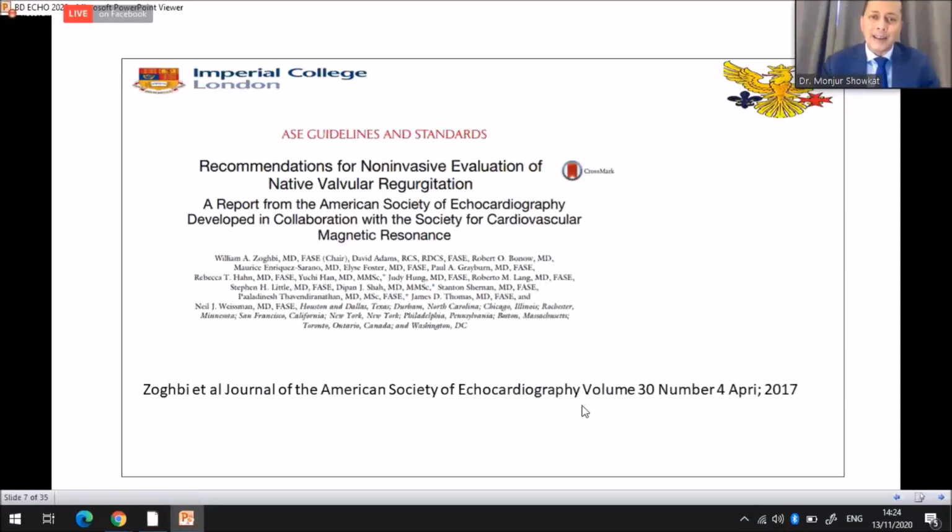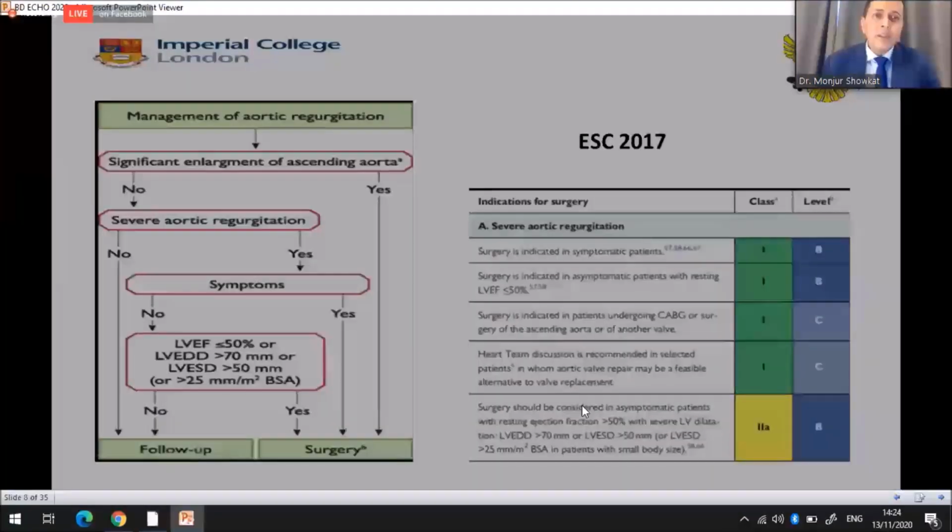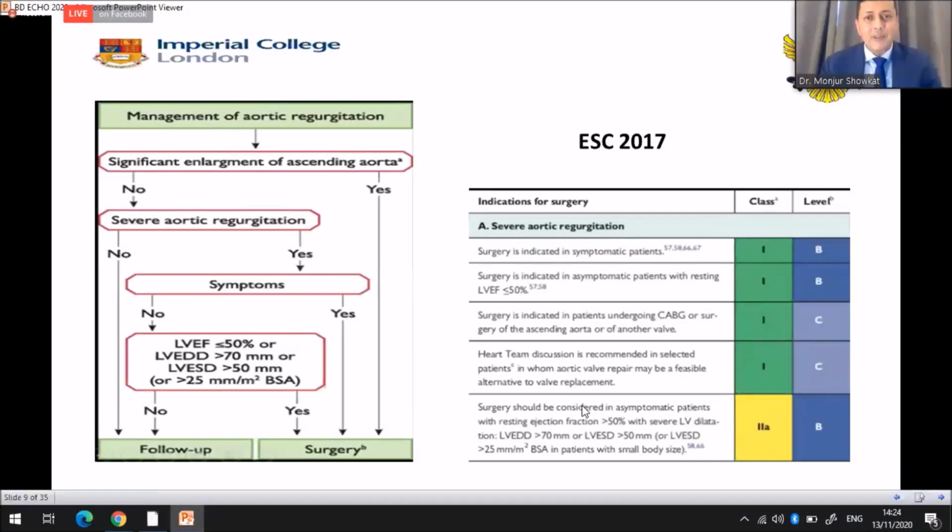An update with a new guideline. So let's talk about the American Society of Echo guideline, which was also published back in 2017. What is new there? They have emphasized the etiology and mechanism of aortic regurgitation. During my talk, I'll briefly show a couple of slides on the mechanism of aortic regurgitation. There is also an integrated approach of 2D and 3D transthoracic echo, and transesophageal echo where needed. That guideline also emphasizes CMR. So just before going to any images, let's refresh our knowledge of the European Society of Cardiology guideline on the management of aortic regurgitation.